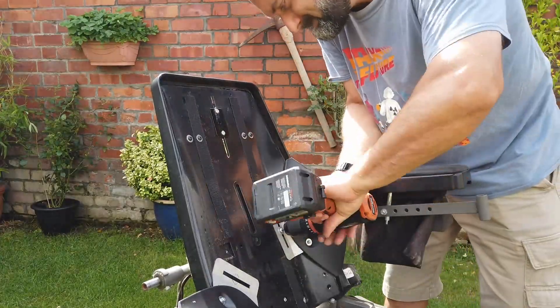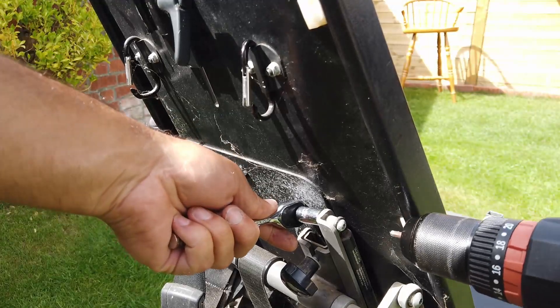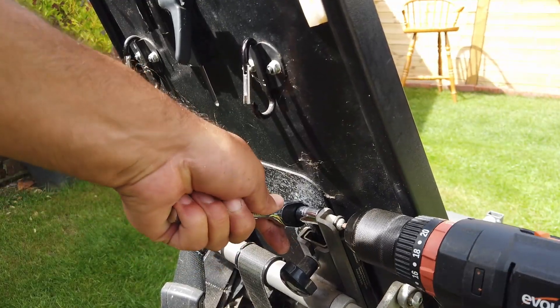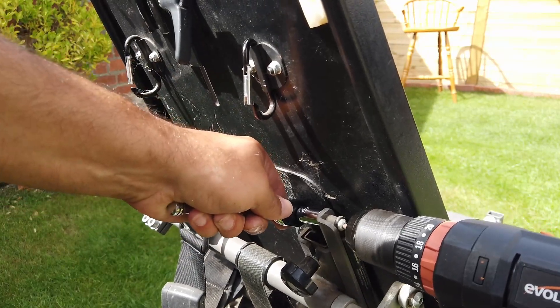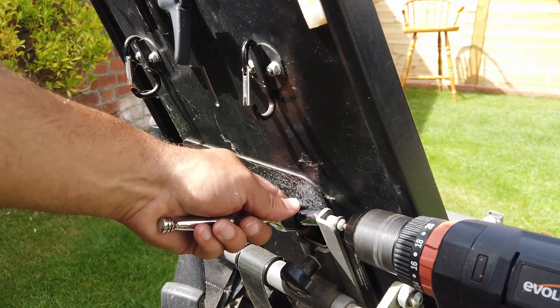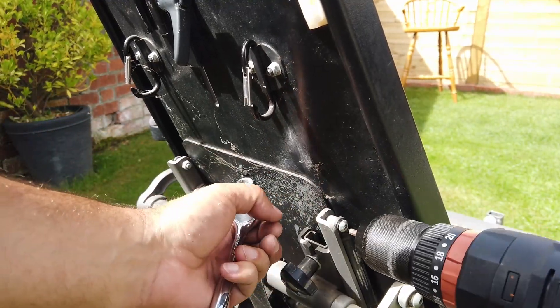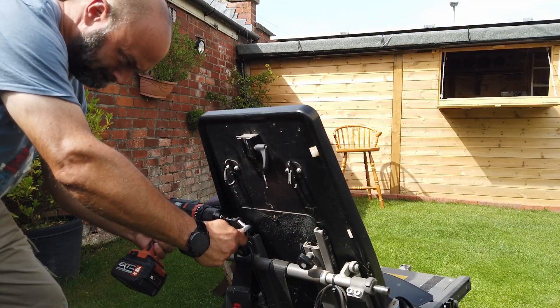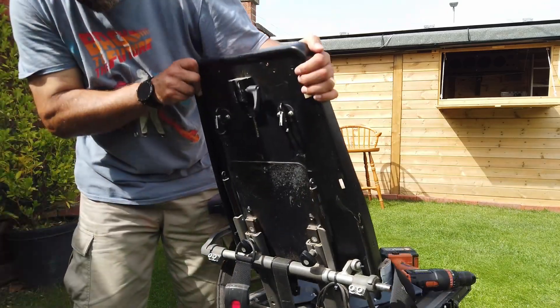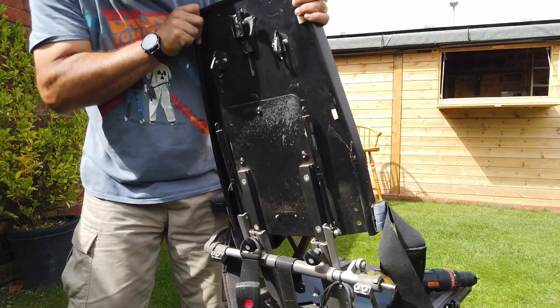The thing I'm looking forward to getting down to is the base with the wheels. Going forwards I think it's going to be quite interesting to see what we can create with the base and wheels of this chair — it will definitely be some kind of automated or remote controlled robot system. Let's get that seat back off and start addressing the mechanical infrastructure.